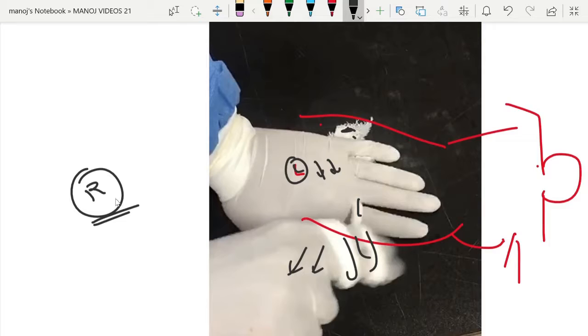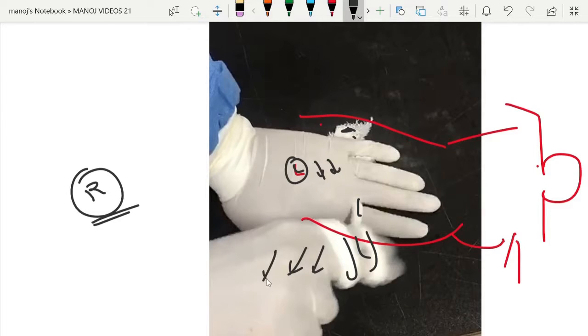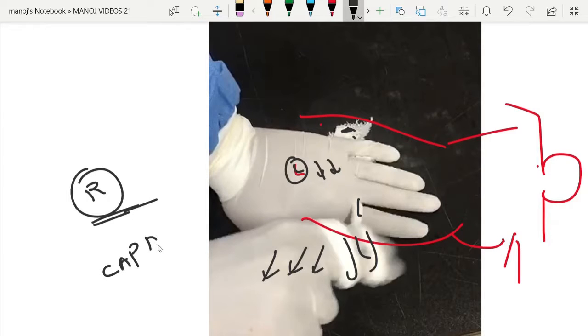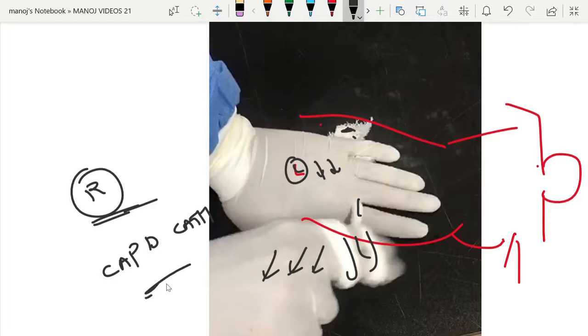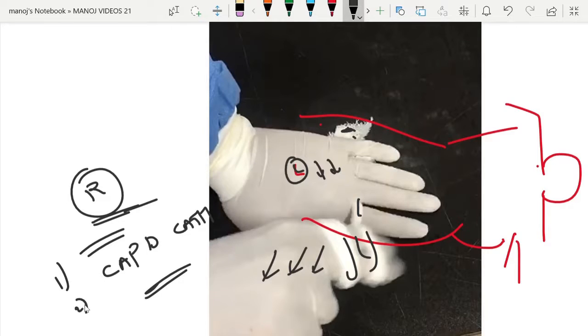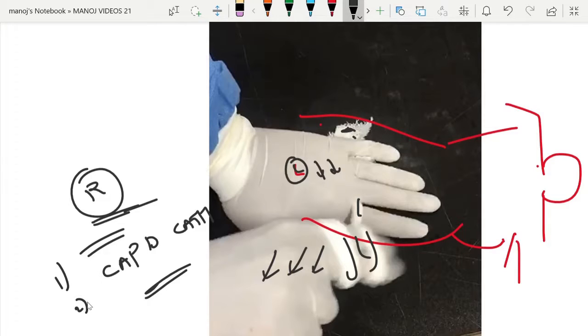Once the superficial cuff is dissected, just we have to give the maximum pull like this. The catheter will come out. So this is the procedure of CAPD catheter removal. Regarding the catheter parts, length of the catheter, how to insert in a pediatric patient, that will be discussed in a separate video.